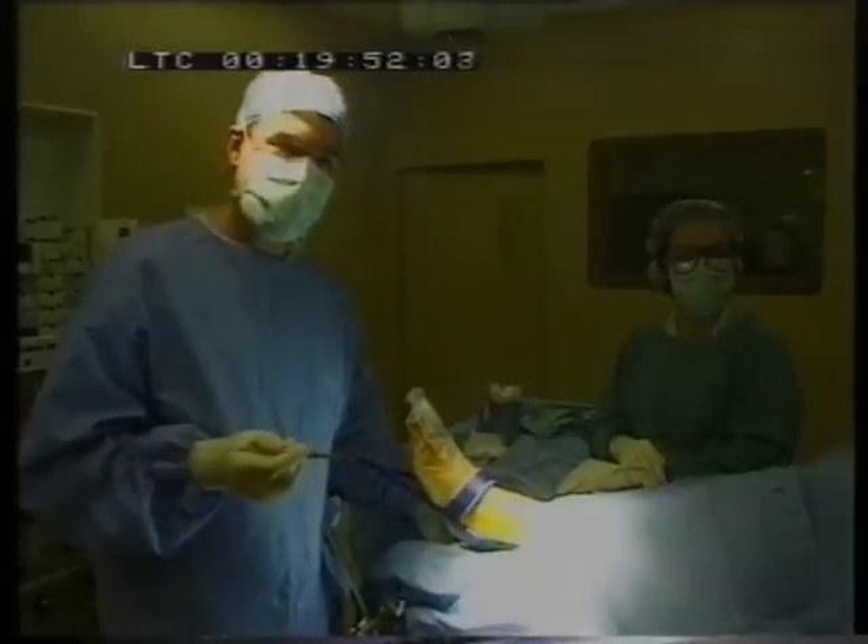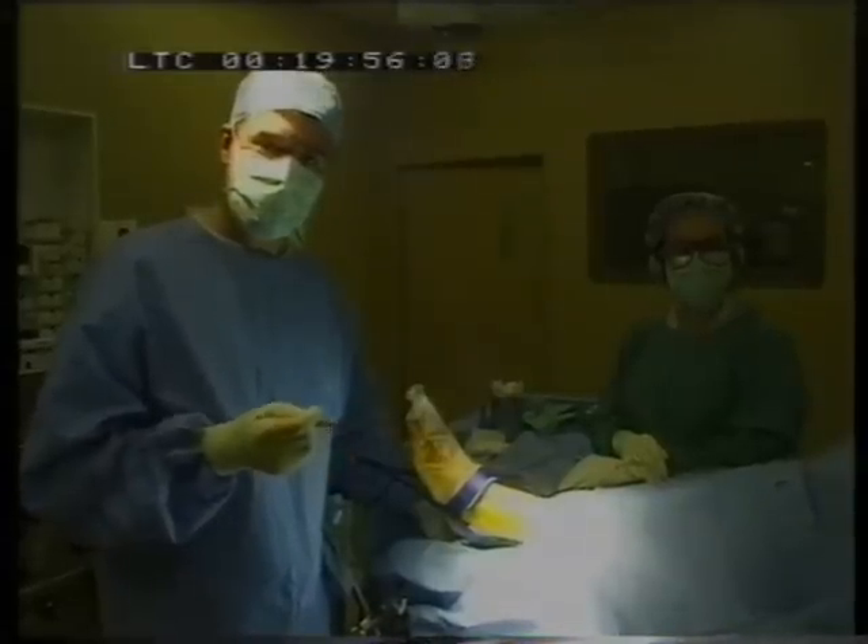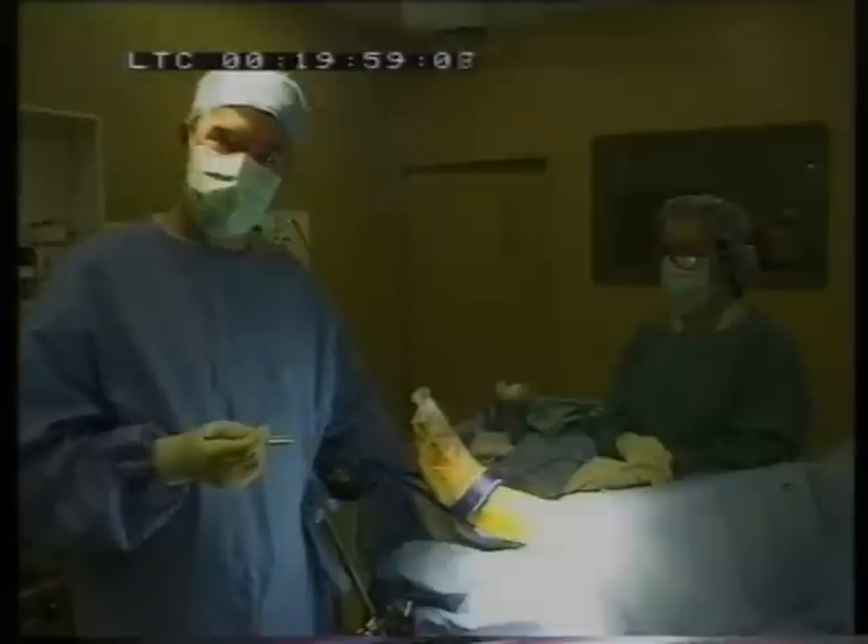What I'm going to do is walk through the way that we set up the ankle to perform an ankle arthroscopy and give you a few technical pointers in order to make the procedure go smoothly.